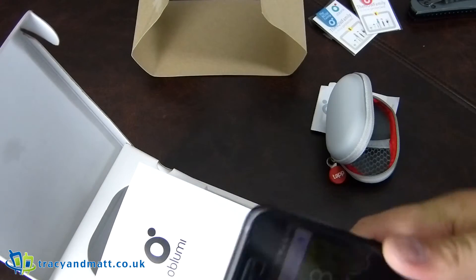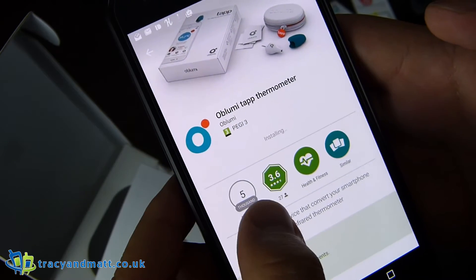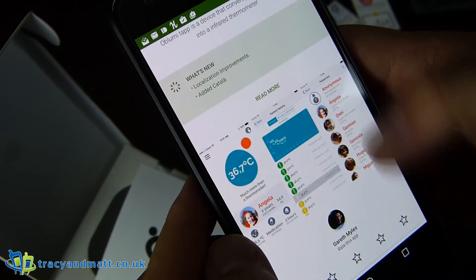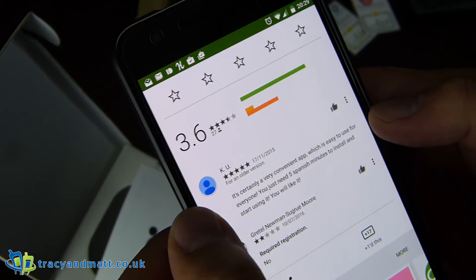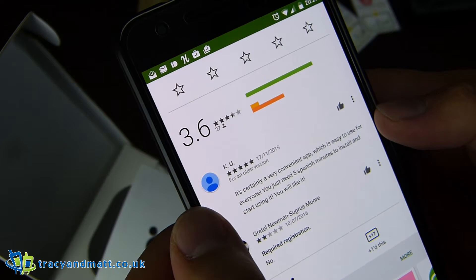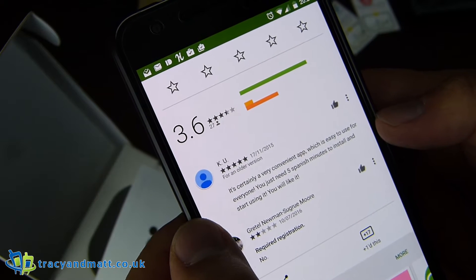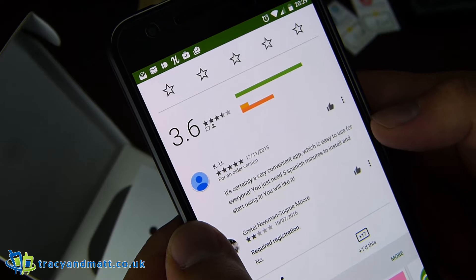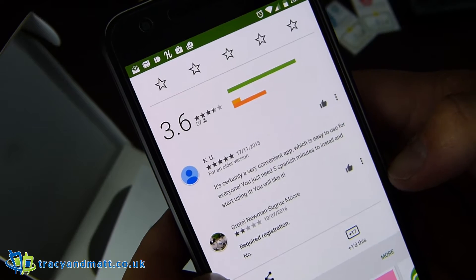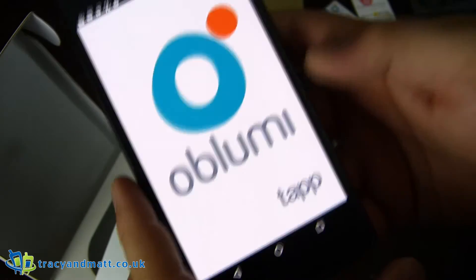What we need to do is download the app. From the app store, it has 5,000 downloads so far with an average rating of 3.6, in health and fitness. What do some people have to say? It's certainly a very convenient app which is easy to use for everyone. You'll need five minutes to install and start using it. One reviewer complained about required registration — okay, that person obviously just threw it in the bin or something. We'll open it up and see what happens.